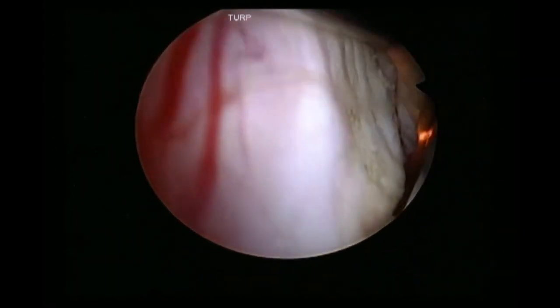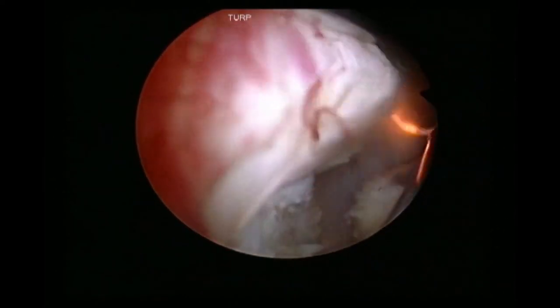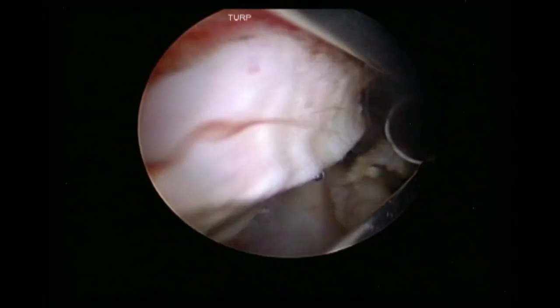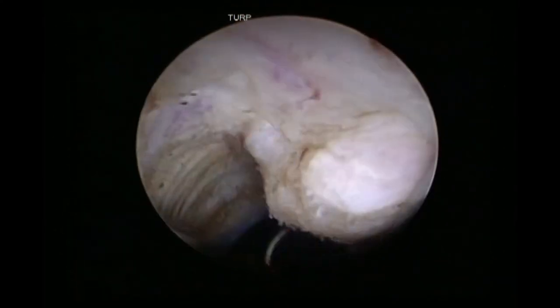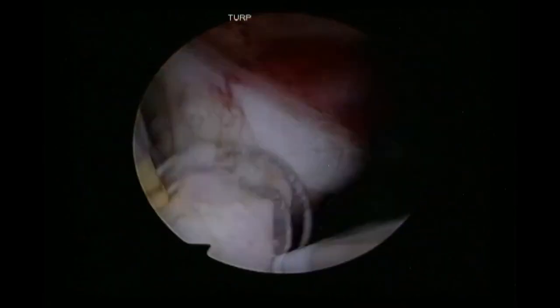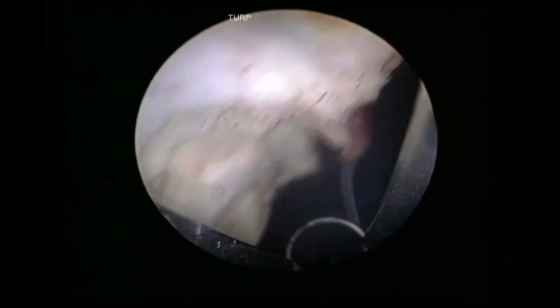This first video is using the Acquired Med loop. I'm resecting the patient's right side — your left side on screen — and it develops a plasma very, very quickly, cutting through the tissue like butter, just like you would expect from a bipolar resection loop. Some of you used to monopolar TURP may be concerned about how quickly you can develop the plasma and resect. Moving to the anterior tissue using the Acquired Med loop, you can see that you can go fairly quickly through the resection, developing the plasma and cutting through the tissue. That is the Acquired Med medium loop — it develops plasma very quickly and you can resect very, very quickly using that particular loop.